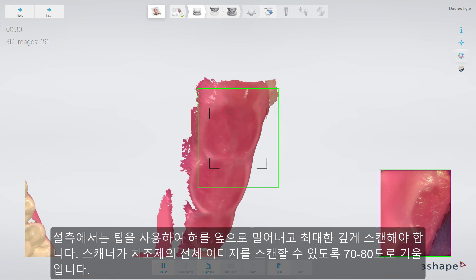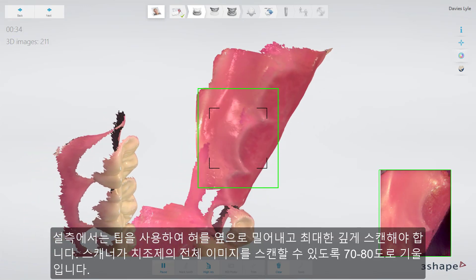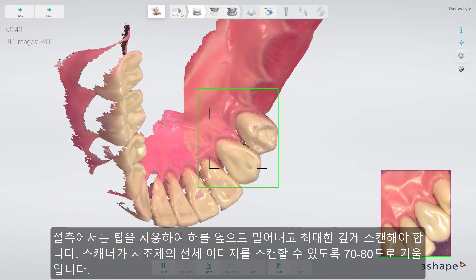When turning lingual, try to go as deep as possible, using the tip to push the tongue aside, if possible with a 70-80 degree angle, so that the scanner can grab images of the whole crest.